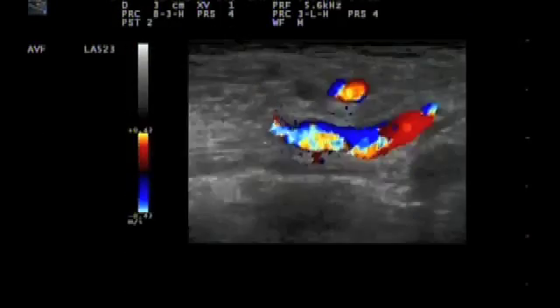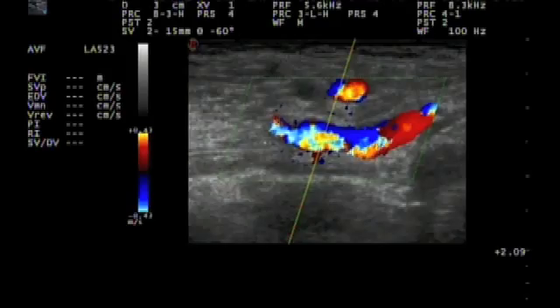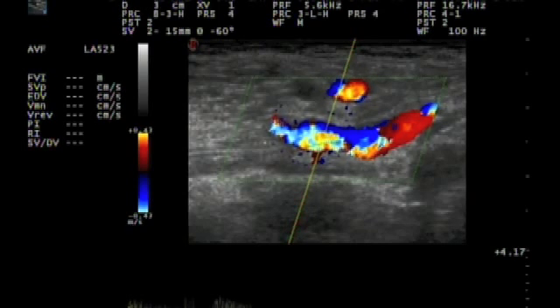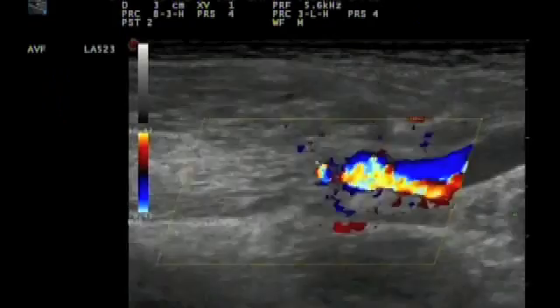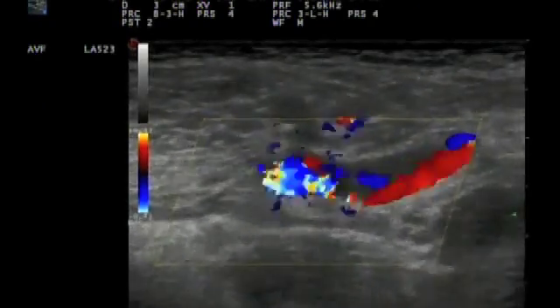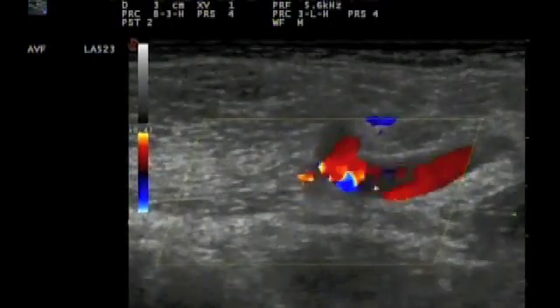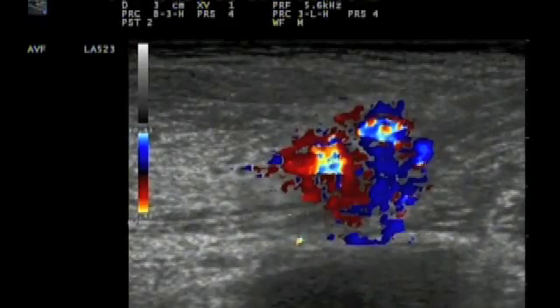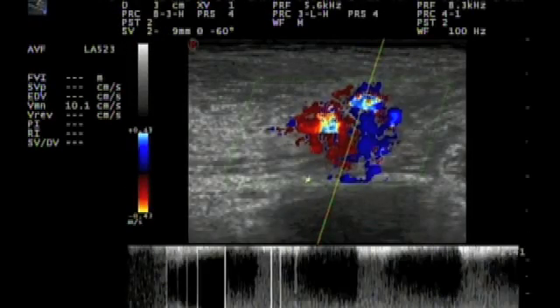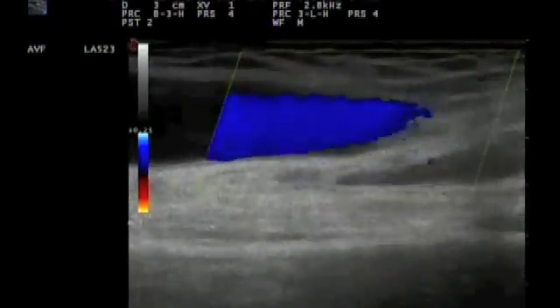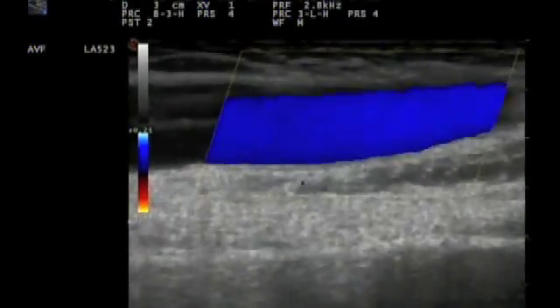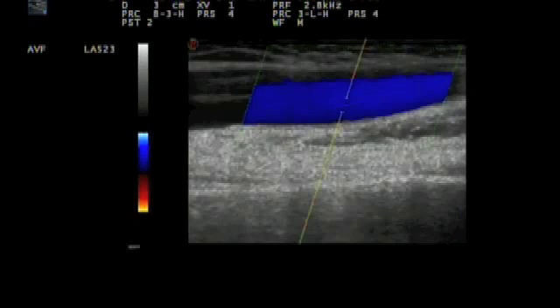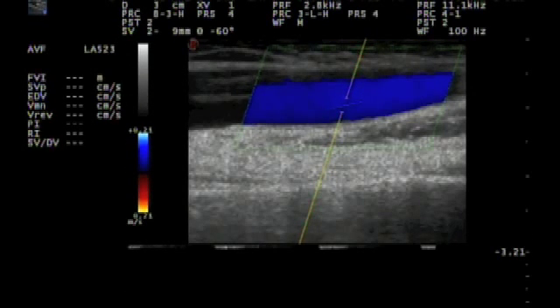Here we have this zone in a longitudinal view, where again we can see high flow velocities based on the color Doppler aspect of the blood vessels. Very turbulent flow with tissue vibration. And then here, when we compare the flow velocity in the cephalic vein 10 centimeters proximal to this stenotic zone, we see very low flow velocities.